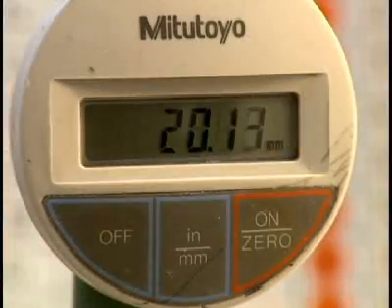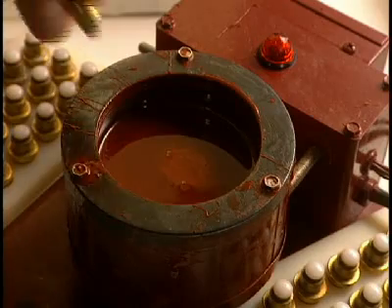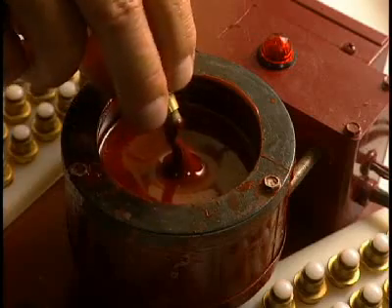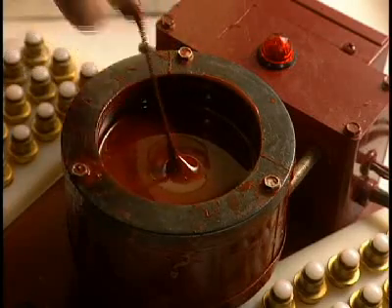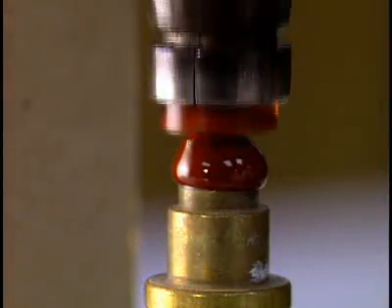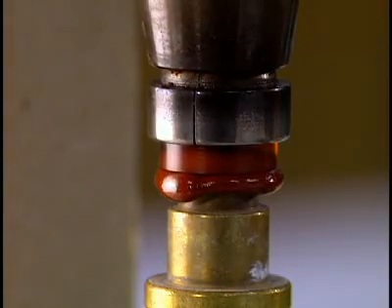A technician measures lens thickness with an extremely precise gauge. They now shape the outer surface — the part which touches the eyelid. The lens is glued with a special warm wax, and when the lens is completed, the wax will be removed by an ultrasound device.